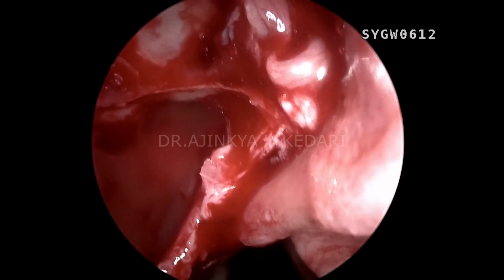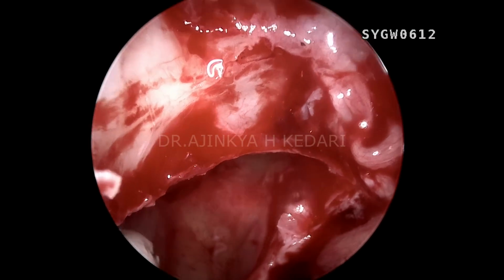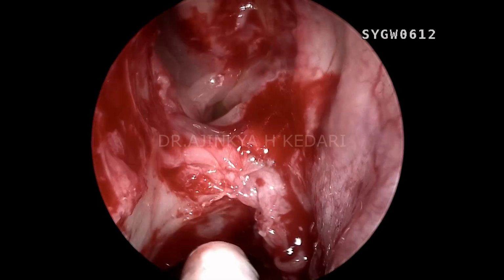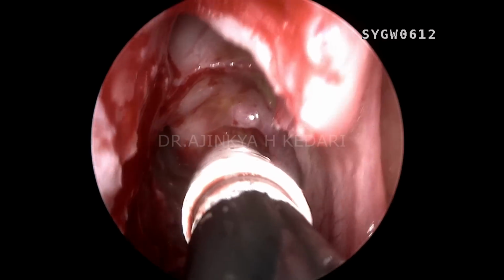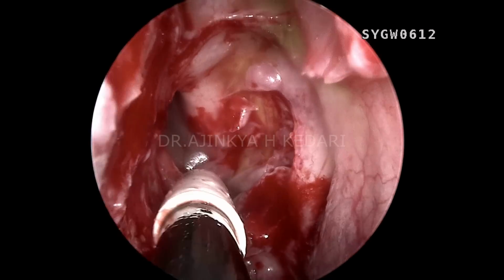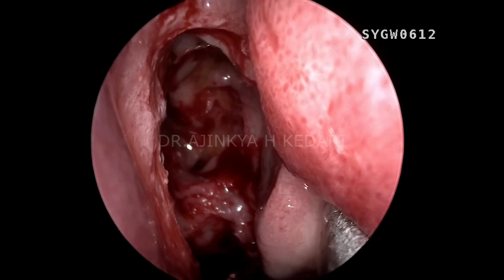So that's the choana down there. That's the maxillary sinus, a huge maxillary sinus. That's the floor of the orbit where the suction is right now. That's the posterior most part of the posterior ethmoids. That's the frontal recess and the sinus above from where the CSF leak is happening right now. At your 9 o'clock is the lamina right now.